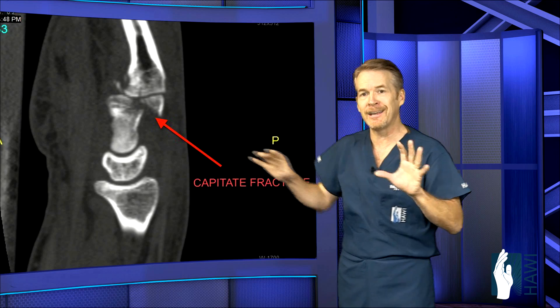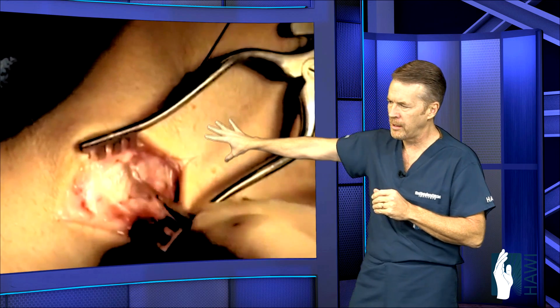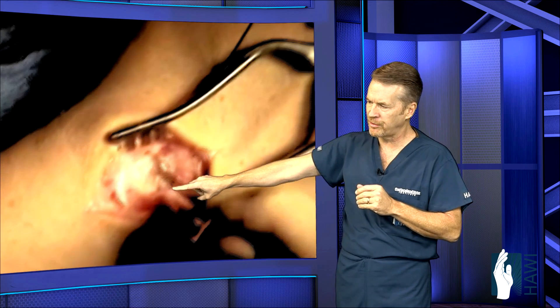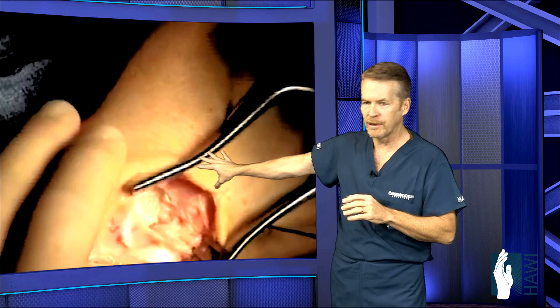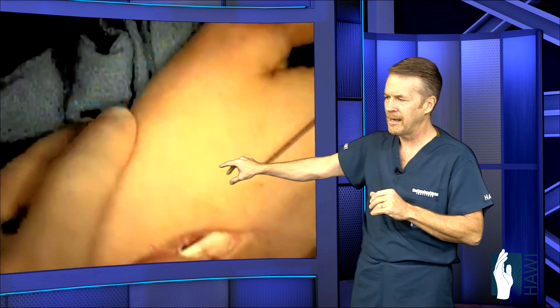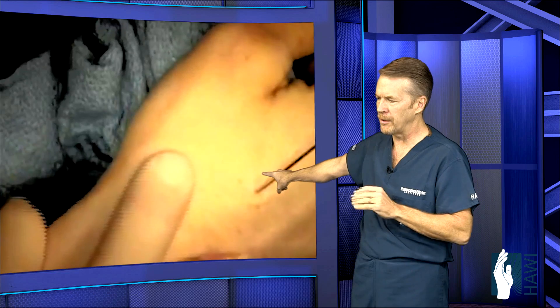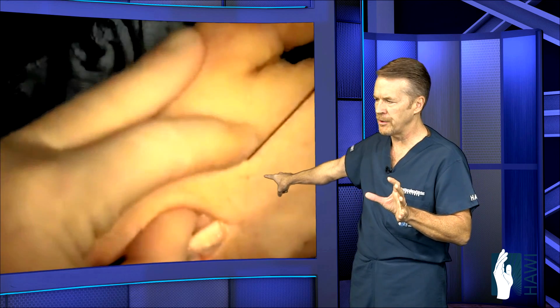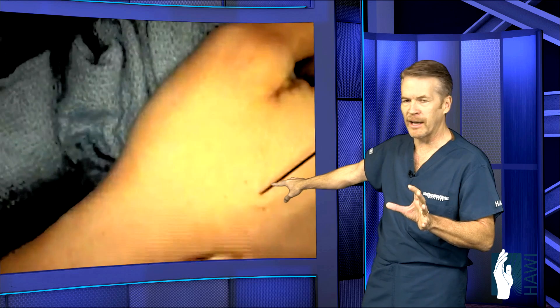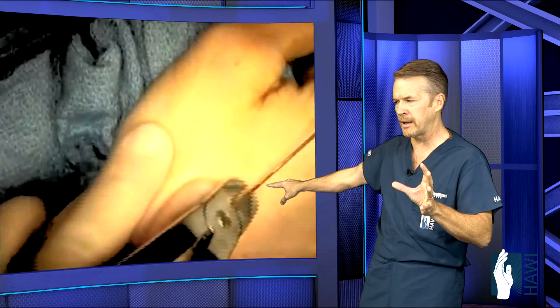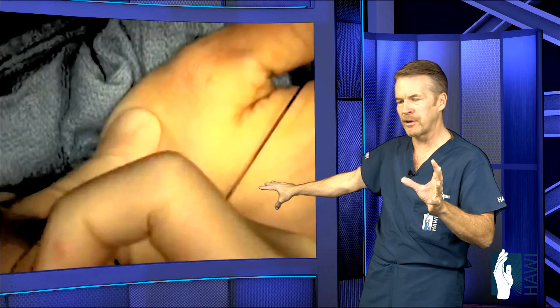He came down, impacted his wrist right into the ground, and after several misdiagnoses we got a CAT scan and could see the fracture — the capitate right here. This is the tip of the capitate with the metacarpal bones to the middle finger, and he sheared this off. Let's take a look at his surgery. We go in right here, put everything back in place, put these pins in right here and here, showing the smooth alignment of the capitate. We're going to snip off the wires right here underneath the skin. He had three pins put in.